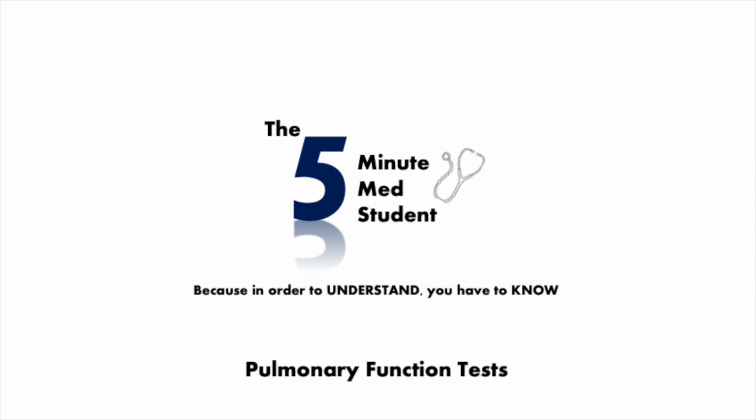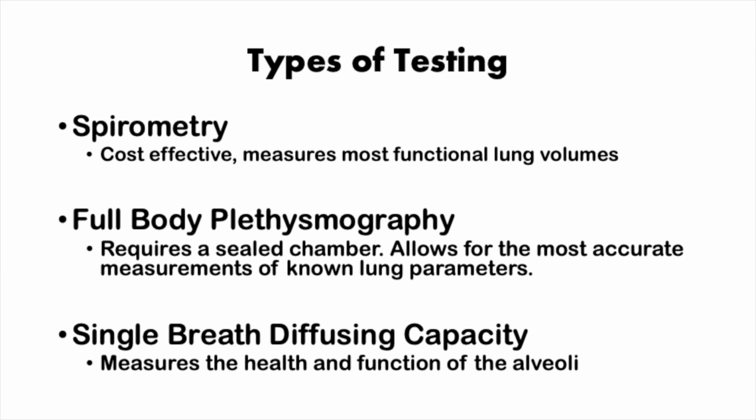Today's topic is pulmonary function tests. There are three main types of pulmonary function testing. There is spirometry, full-body plethysmography, and single-breath diffusing capacity.